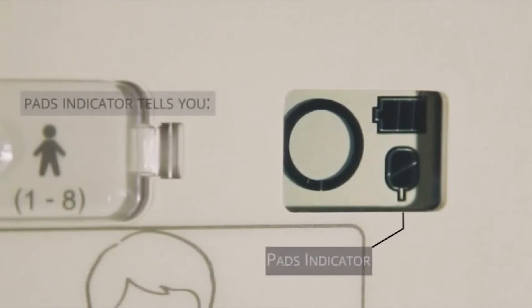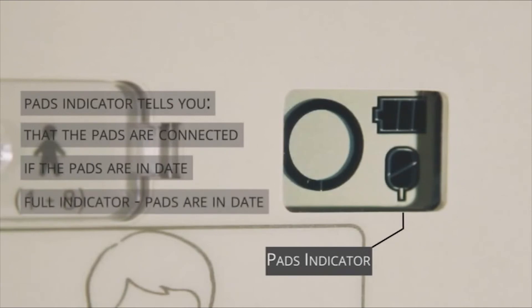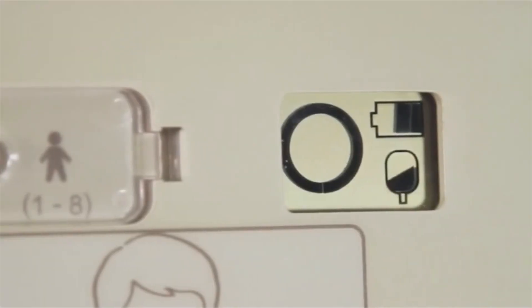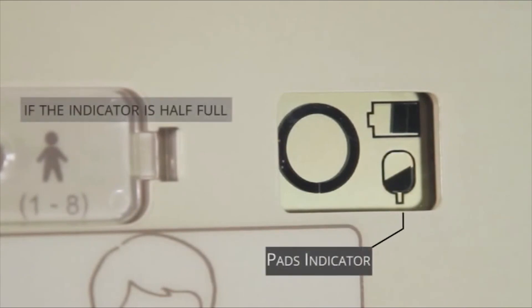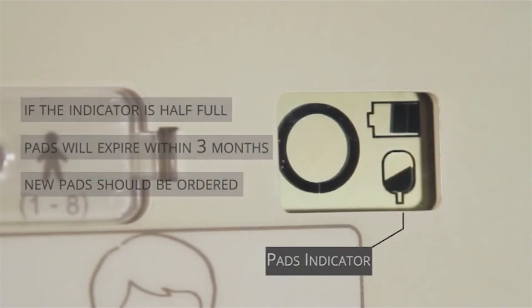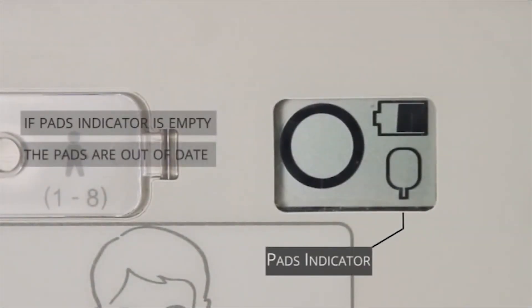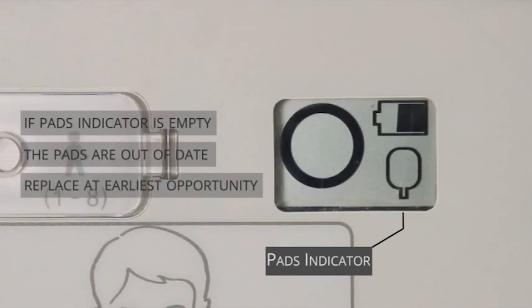The pads indicator tells you that the pads are connected to the AED and whether they are in date. If the pads indicator is full, the pads are in date. If the pads indicator is showing as half full, the pads will expire within three months and new pads should be ordered. If the pads indicator is empty, the pads are out of date and should be replaced at the earliest opportunity.